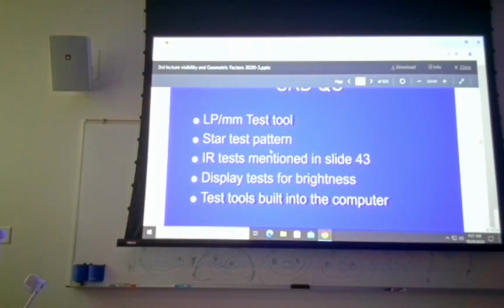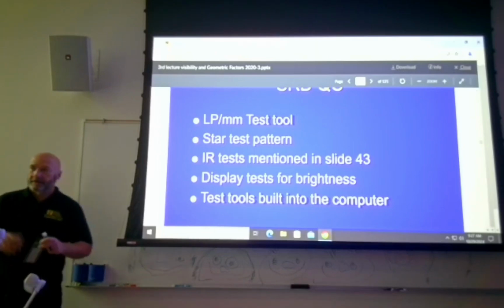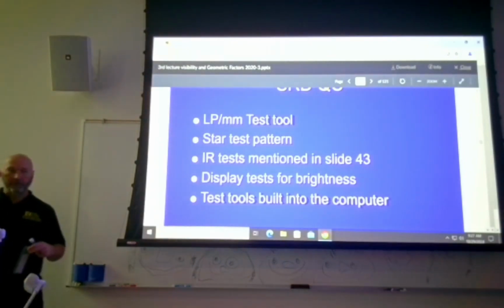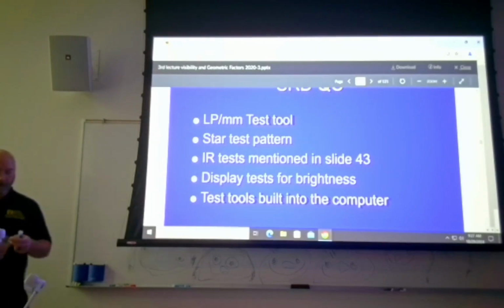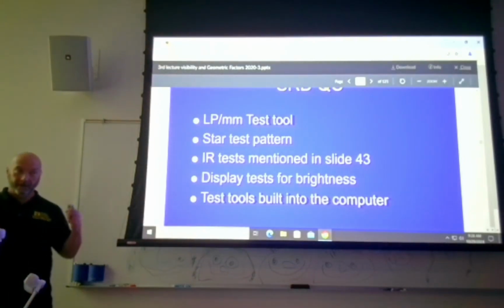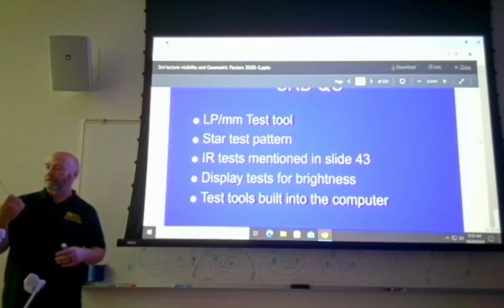So they're going to read how well the display system is presented. But we also have some things that we have to test the X-ray tube as well. All right, so things that can affect spatial resolution: X-ray tube blooming, right? You remember what blooming was? You stand on the rotor too long, you build too large of a space charge, you get an increase in the focal spot size, you lose spatial resolution. Over time, your X-ray tube can lose spatial resolution as well. So not just your display, but your X-ray tube can lose some spatial resolution.